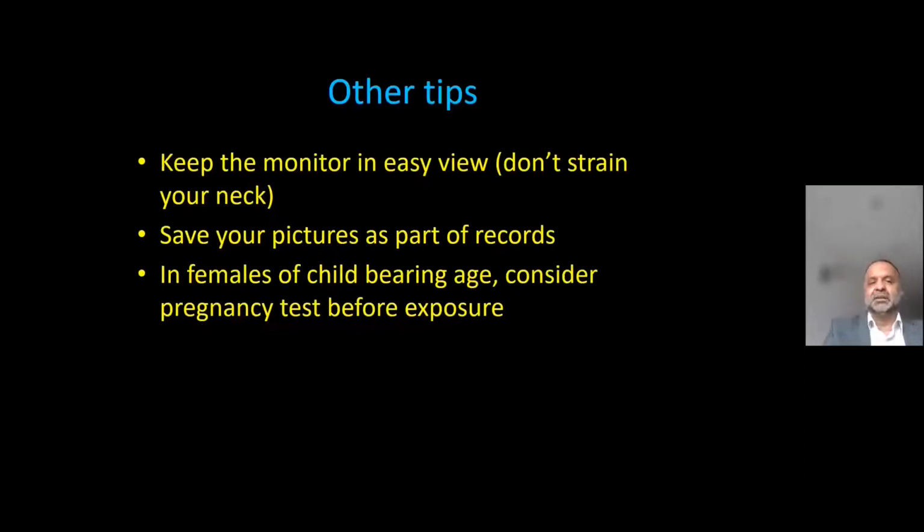Okay, then I'm going to give you some other tips. Keep the monitor in easy view. If your monitor is like that and you're doing the procedure here and looking at the other side all the time, it's not going to be easy for you in the long term.